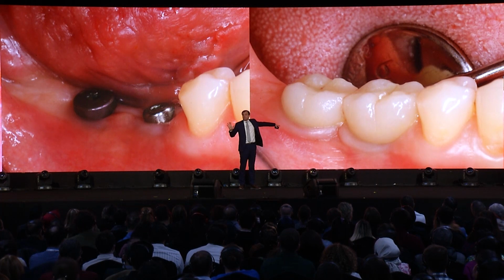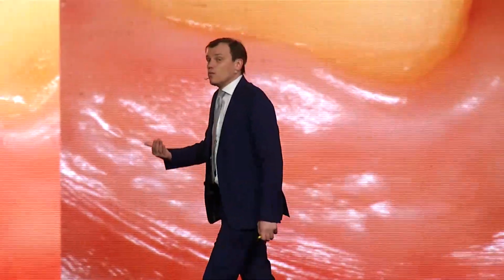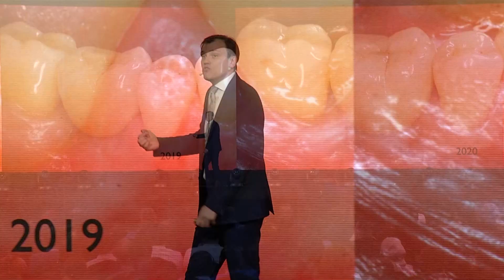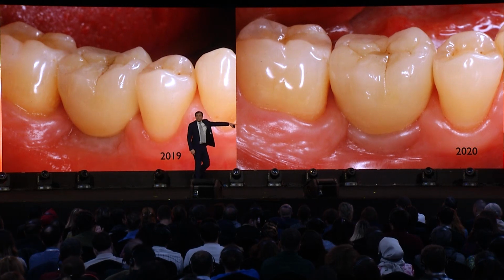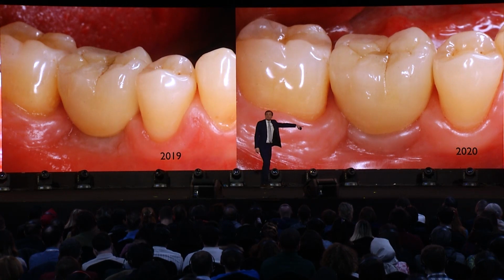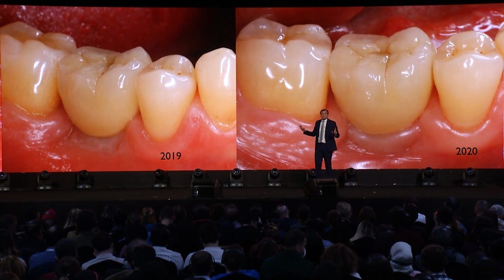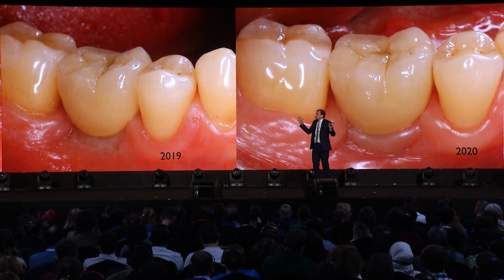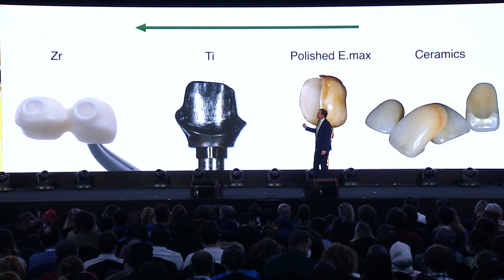No grafting. So who would graft now? So that's the power of zirconia when you use it in a correct way, when you use all other things. Look, lack of the tissues after just 1 year. Growth of the tissues. No grafting. I don't have any reason to lie to you. Why should I? So that's really the power of zirconia.